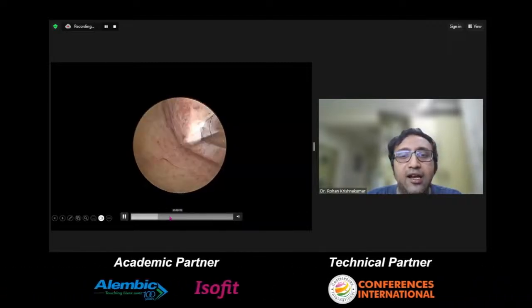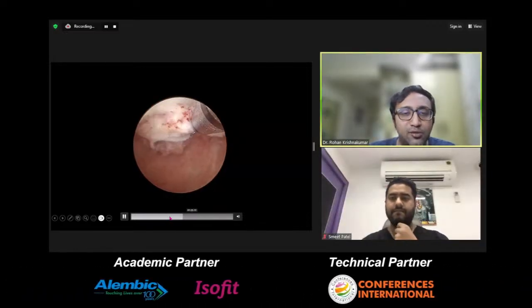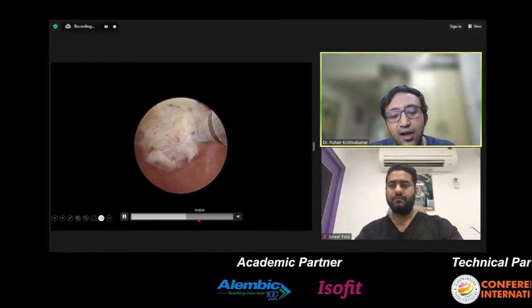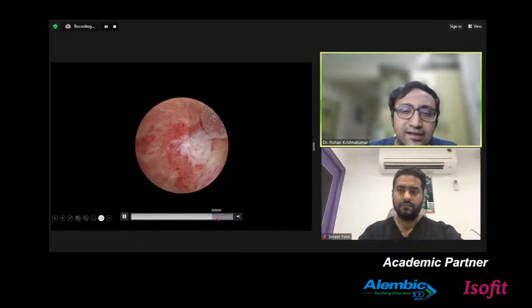And you can see it's cutting through the myoma like a piece of cake. There's hardly any tissue. Usually, when we use a resectoscope, we see those big bubbles. We see tissue lying around the uterus, obstructing our view, and then we have to stop, remove everything, clear the field, and then go ahead. So sometimes with the suction move, it may show some bleeding, but it easily clears off.